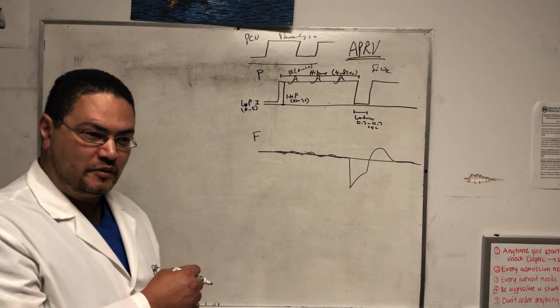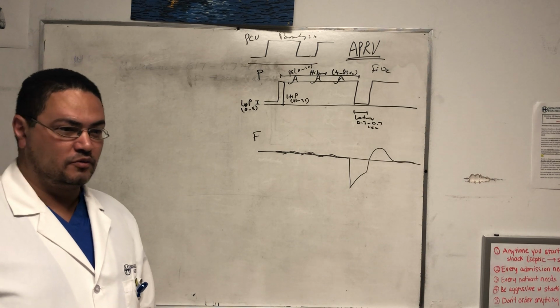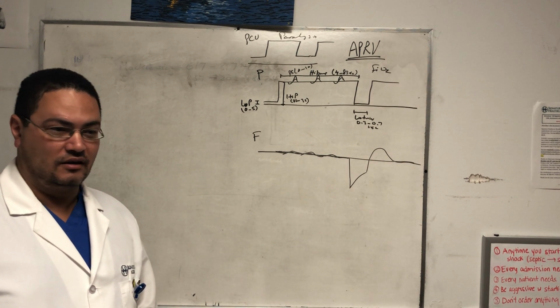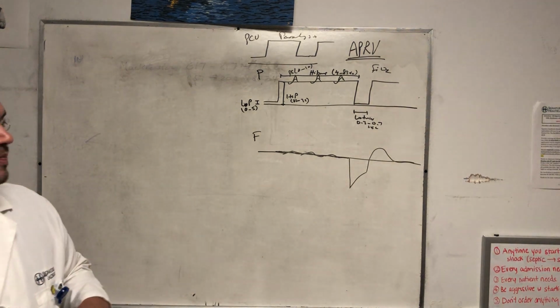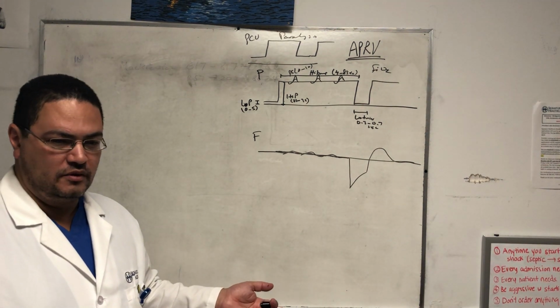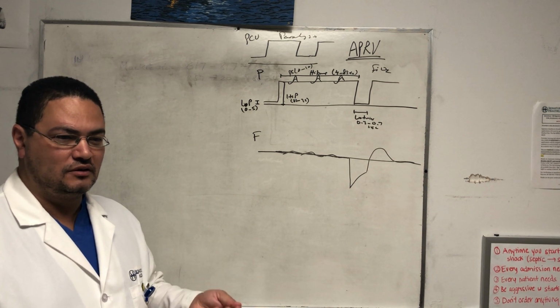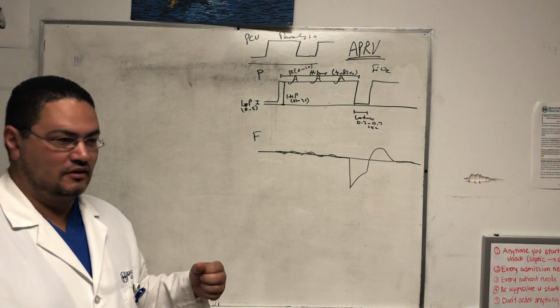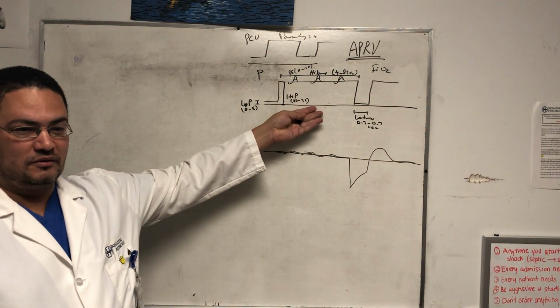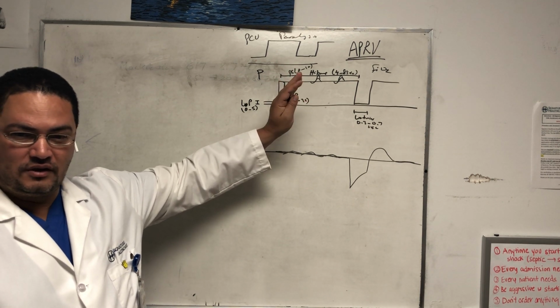If we call that the auto peep here, the respiratory therapist is going to have a heart attack, because he's going to find that the auto peep is 55, and he's going to seize in front of everybody, right? So we don't call it the auto peep. I'm going to start telling you throughout this the claims to fame of the APRV. The first claim to fame that we talked about is that it doesn't require paralysis, even though it gives a long I time.